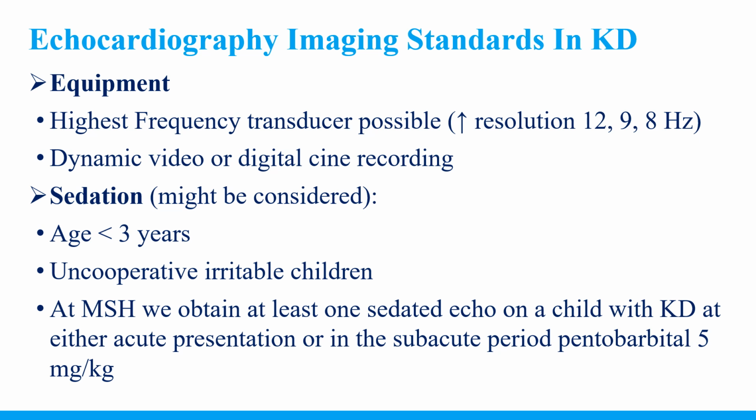At my institution at Mount Sinai, we obtain at least one sedated echo on a child with Kawasaki disease at either their acute presentation or in the subacute period, and we use pentobarbital 5 per kilo, and we do this in the echo lab, and we have a sedation nurse.